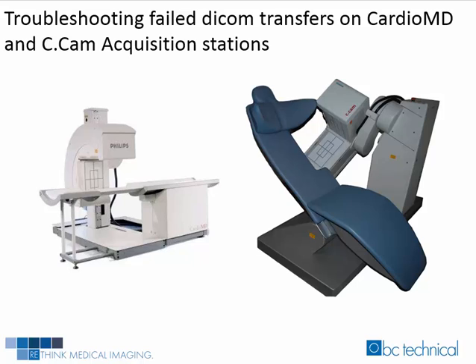The Philips CardioMD and Siemens C.Cam are both dedicated nuclear cardiology gamma cameras. They also use the same acquisition software, even though they go by different names. Both systems export data the same way.